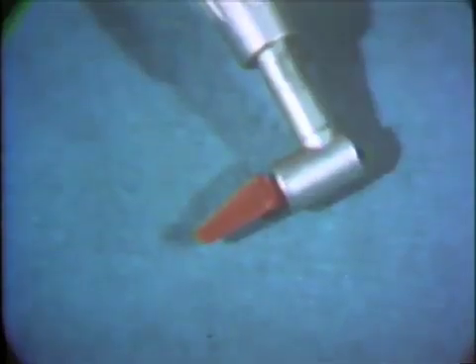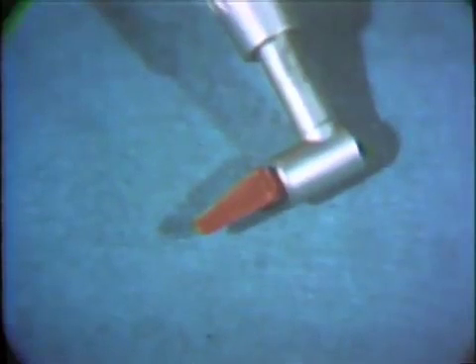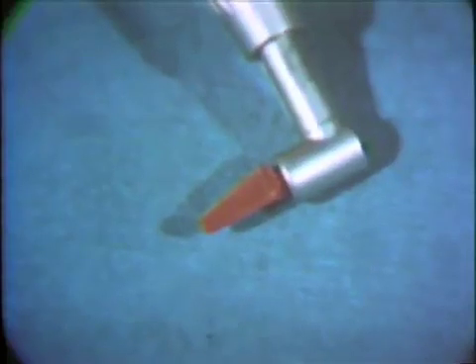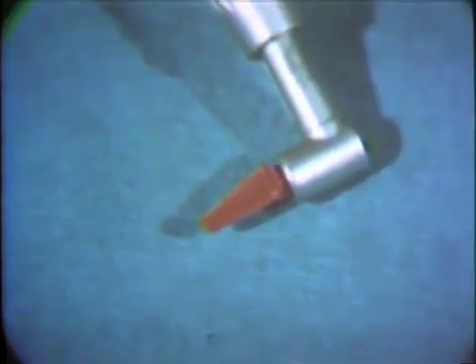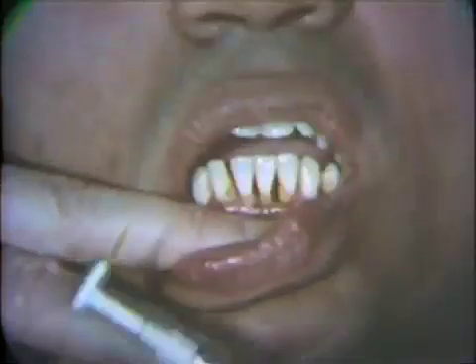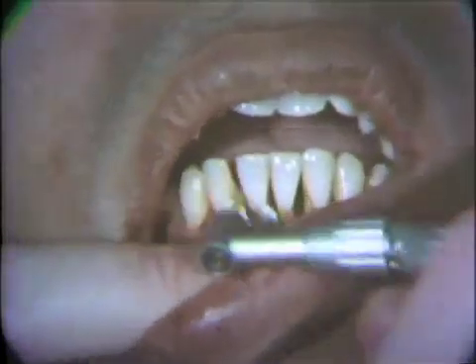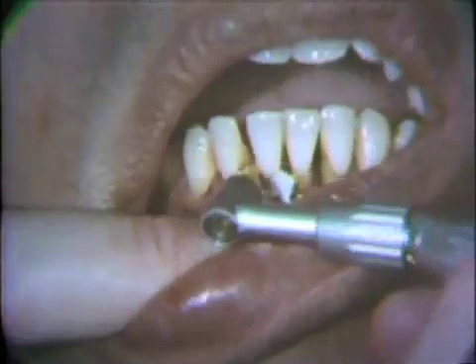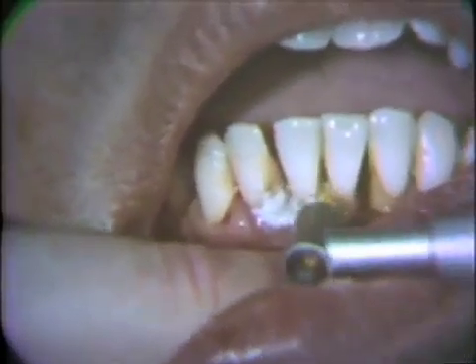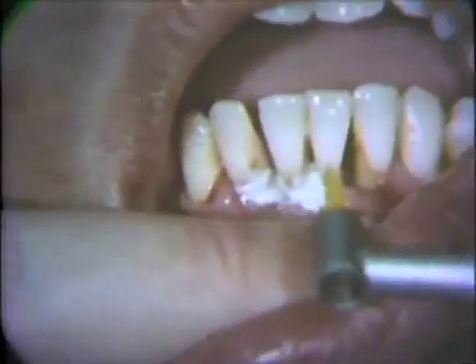A new polishing contra-angle which provides a back and forth action of the tip has recently been introduced for polishing interproximal surfaces. It is called the EVA system for prophylaxis and can be attached to a regular handpiece. The tapered triangular plastic tips have a series of cross-cut grooves to hold polishing paste, and different size plastic tips are color-coded. The instrument is used on the interproximal surfaces of the mandibular incisors. The polishing paste is first applied to the teeth, and the instrument can be used from the lingual or palatal aspect equally well. Polishing paste of various particle sizes can be used; however, a very fine paste should be used to provide the final finish.